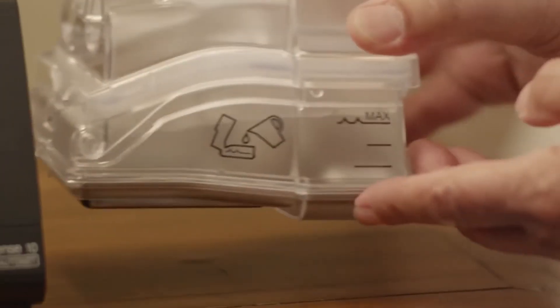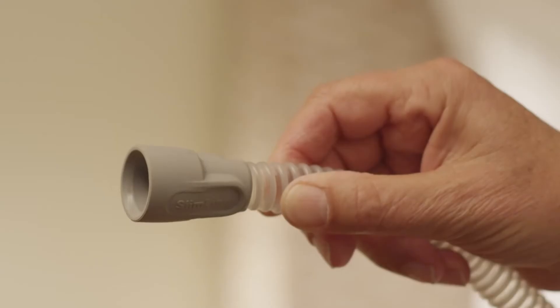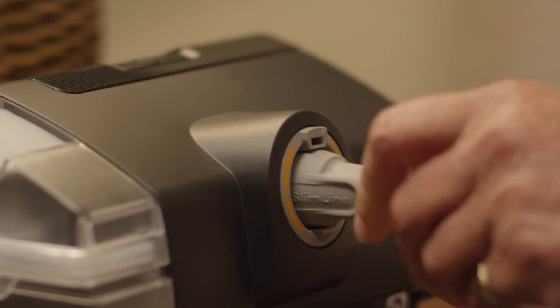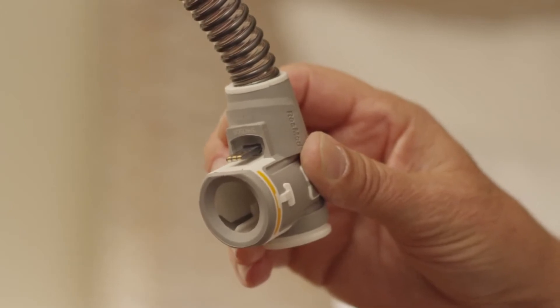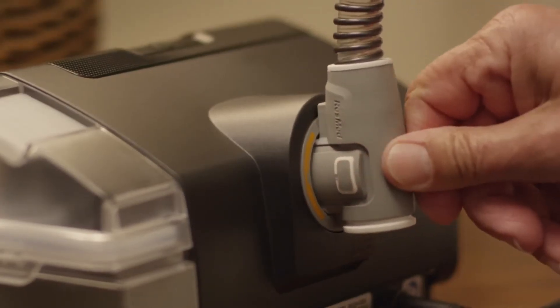Insert it into the side of the device and connect the air tubing. If your machine came with a slimline tube, simply connect it to the back of the device. If it came with a ClimateLineAir Heated Tube, hold it by the orange cuff, line it up with the connector port, and push it until it clicks into place.